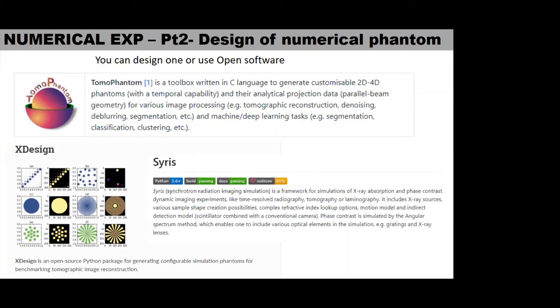There are other reconstruction algorithms that have something similar to this multiple energy CT in a single energy unit. One of them is the metal artifact reduction reconstruction algorithm. So, yeah, this can help, not as much as the multiple energy CT, to deal with streak artifacts within images and all that.